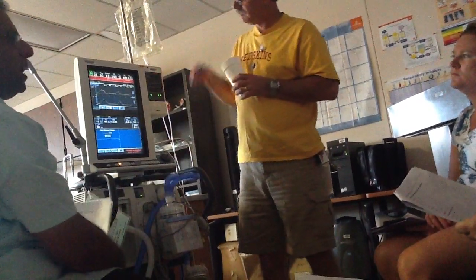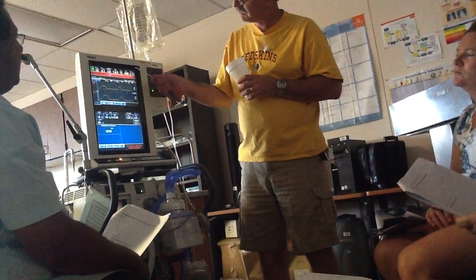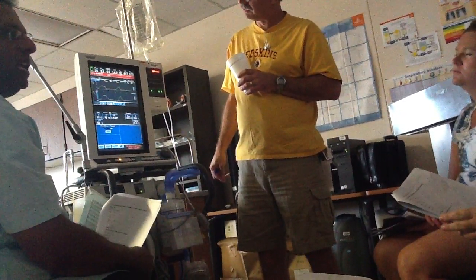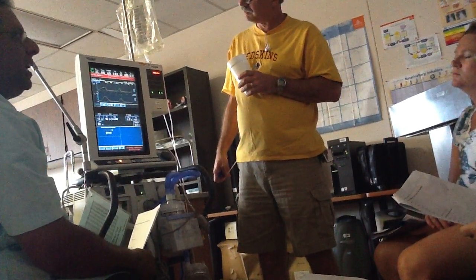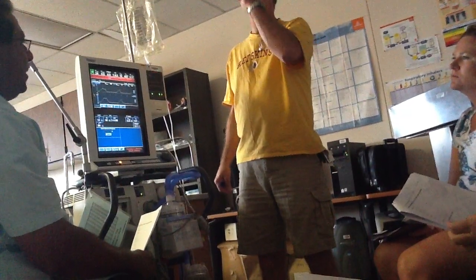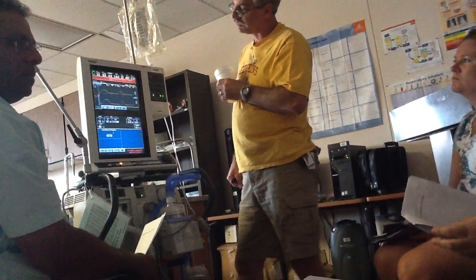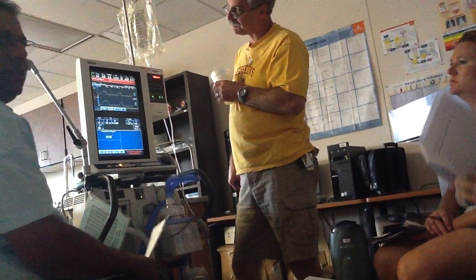And what is your tidal volume now? Is it the exhale tidal volume? It's 498. What was it before? I don't remember. He was set at 590. And he was getting 520 because of the high pressure. Now, when you switch him over to pressure control, he's 497. Is it too big of a difference? 520 versus 497. It's not that bad, right?